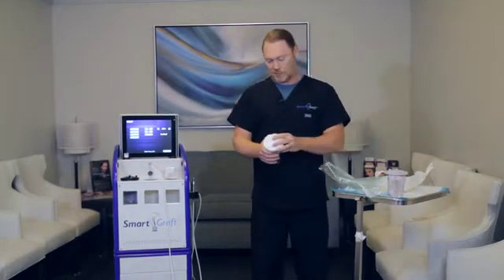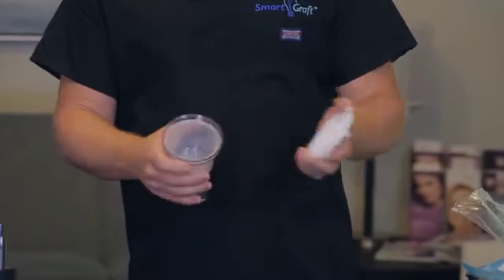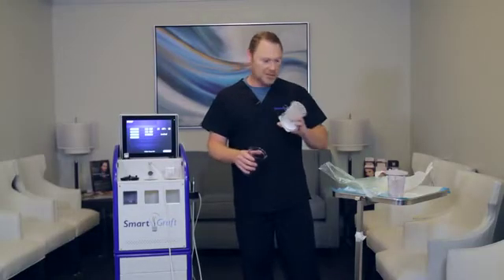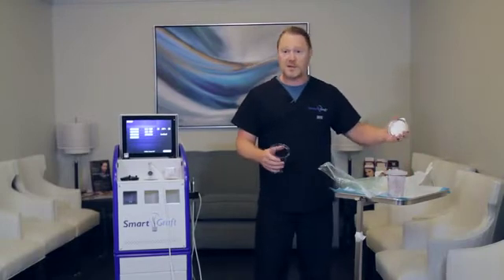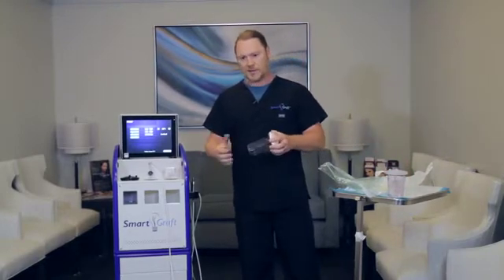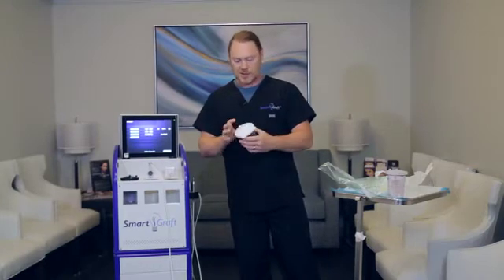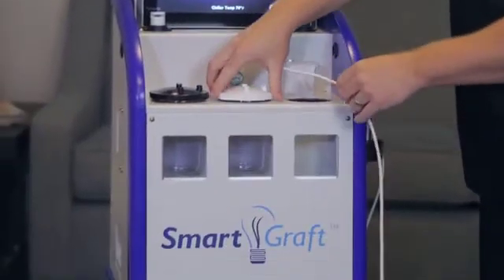The second one in position would be the white one, the one with the white lid. Inside it has a second graft canister. You do not need to use this right now — that is just for efficiency of handing off the grafts to the other technicians. You want to make sure these lids are securely tightened and put that one in the middle position.